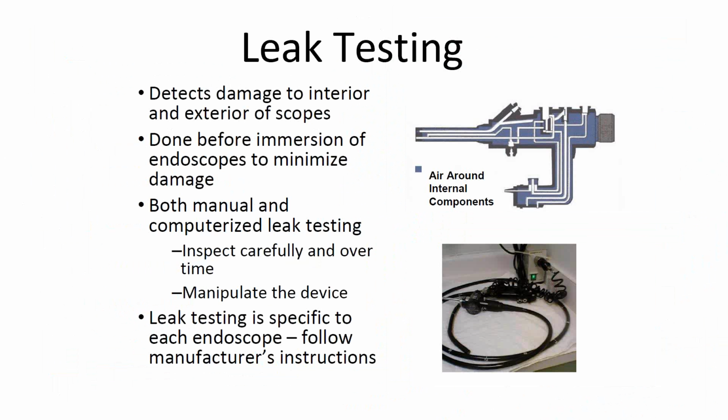So we need to follow their IFU, or instructions for use, on how to do that properly. And leak testing is performed prior to immersing the endoscope in the detergent solution during cleaning to ensure that it's watertight and it's not damaged in any of the interior or exterior places on the scope. And there are different ways to perform leak testing.